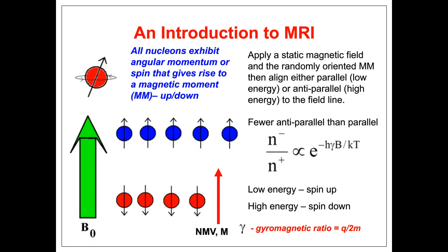So the MRI signal that the RF engineer eventually detects originates essentially from the nucleons of specific atoms. From a quantum mechanical perspective, a study of the single electron proton system, which is really hydrogen, shows that the proton has the property of angular momentum that has the same dimensions as that of, say, an orbiting particle in the macro sense. And so this angular momentum is referred to as spin. So it's not a physical spinning, but since it has the same dimensions, it's often called just spin. And that leads to a magnetic moment associated with each nucleon.